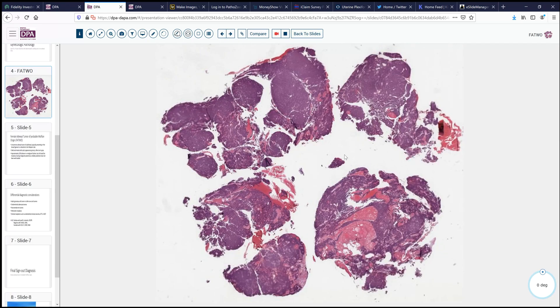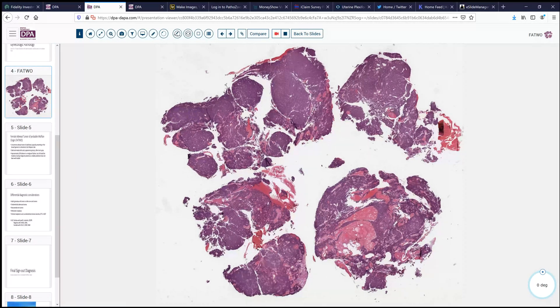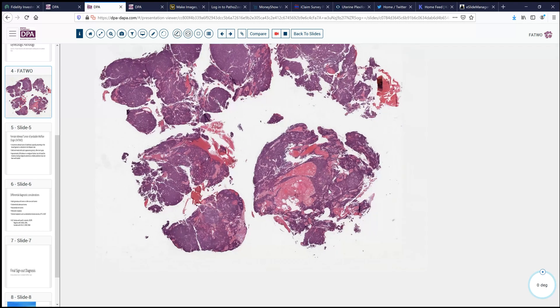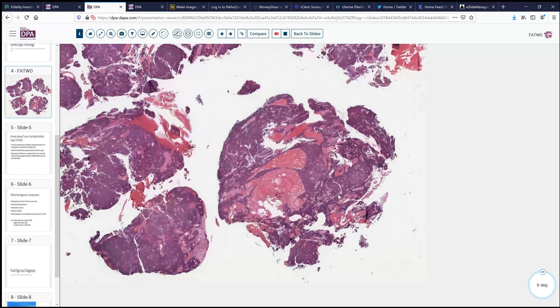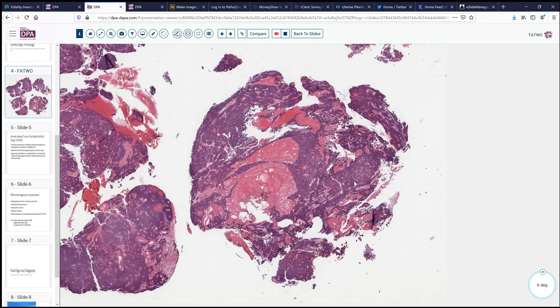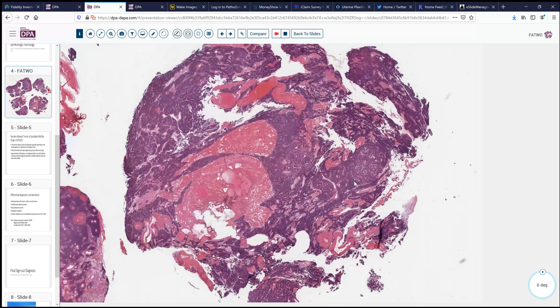A frozen section was performed, and our initial impression was that this might be a sex cord stromal tumor, perhaps an adult granulosa cell tumor or something of that sort, because it was quite cellular and had sort of an organoid-ish pattern, some cystic spaces, and so forth. However, on permanent sections and further immunohistochemical study, that did not seem to be the correct diagnosis.